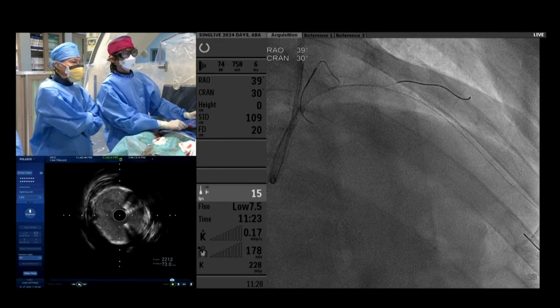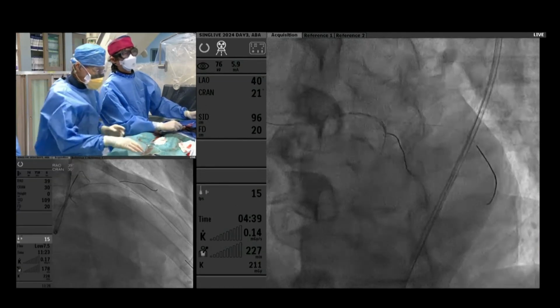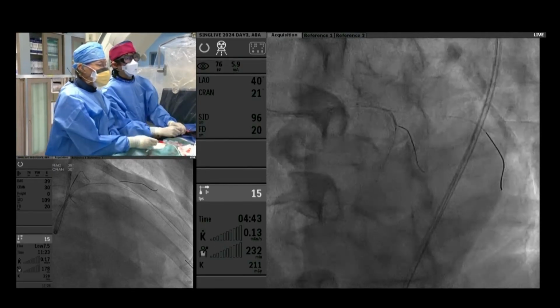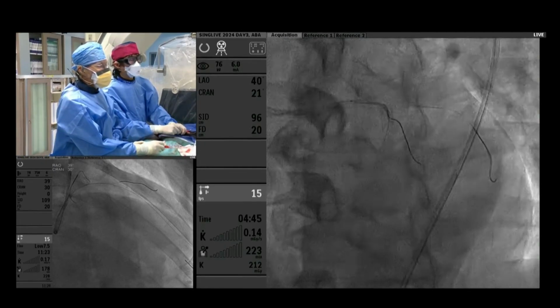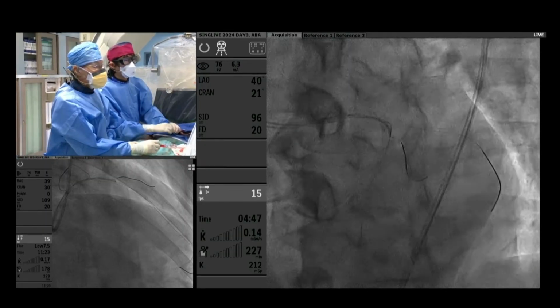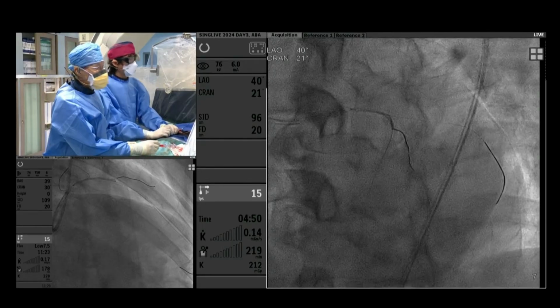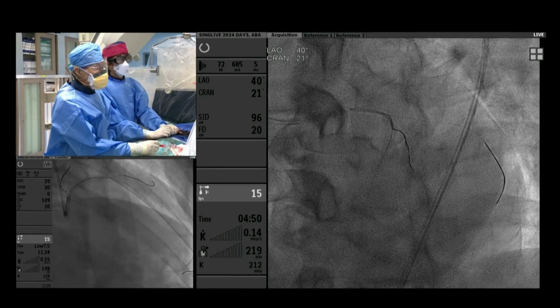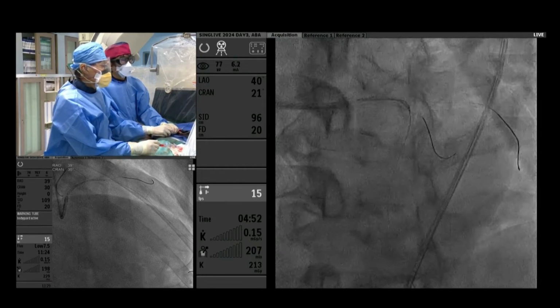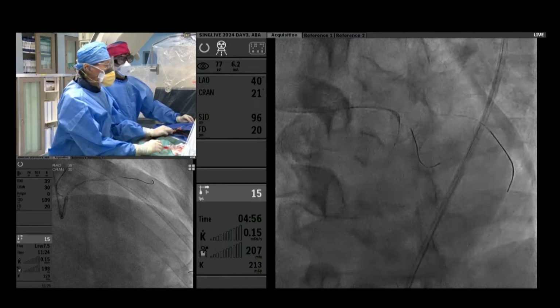Maybe at this point we should do a little bit of a test, to see where the ostium is. Yeah, we definitely need some tests. I think there are a few options that we can do to inject contrast. One, of course, is to use a guide extension catheter, but we've got a couple of wires there. Another option is to inject directly, and a third option is to use a Thrombuster, which I've used sometimes to inject dye.